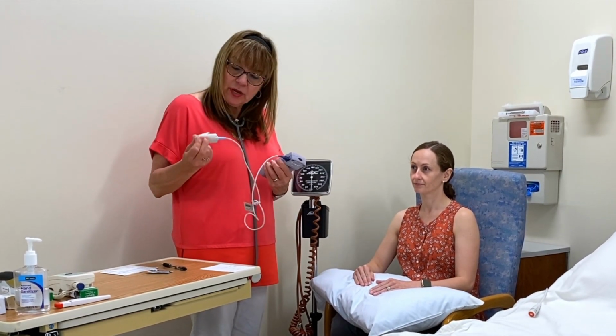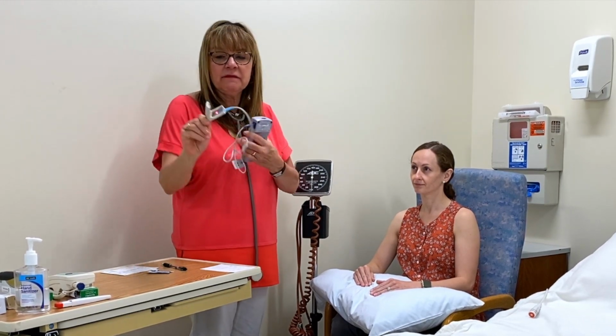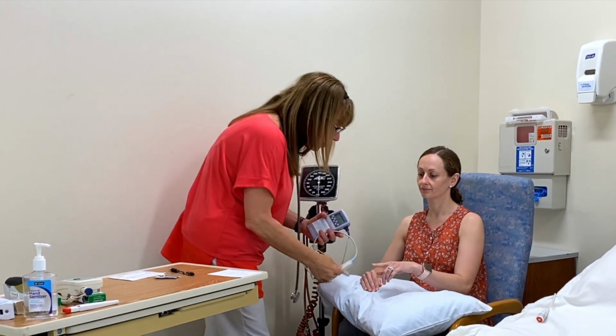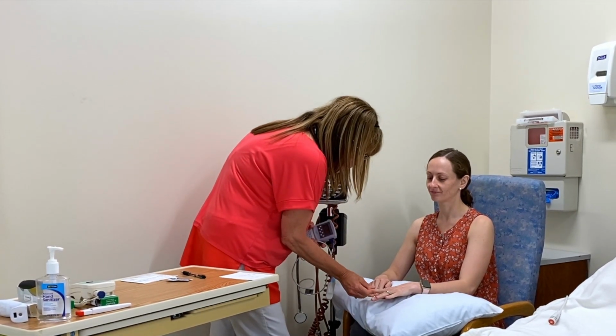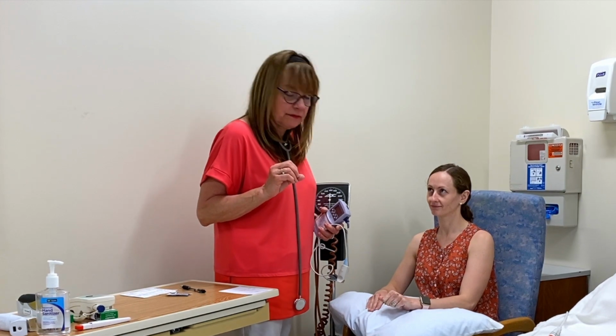There's a light on the inside of this finger probe. The light needs to go over the nail bed. Her hands are a bit cool, but she's got good capillary refill. Acrylic nails might be a faux pas, especially if it's a really dark color, because the light won't go through it.